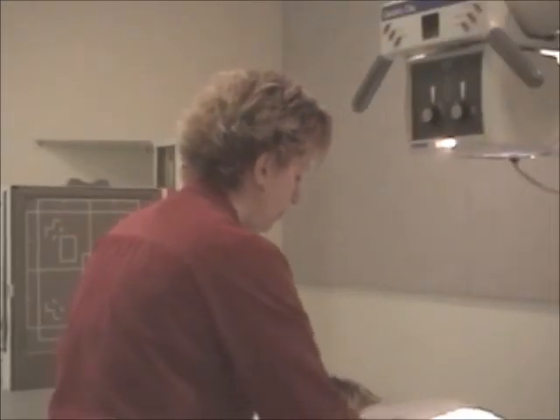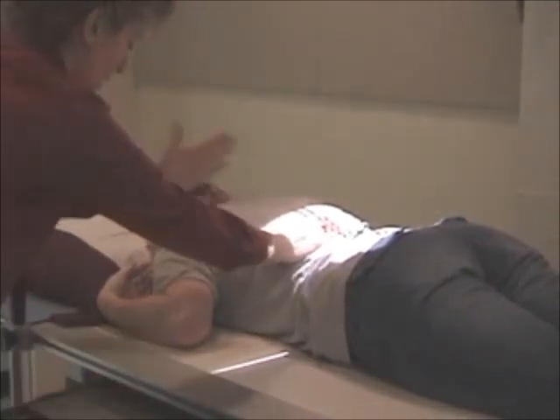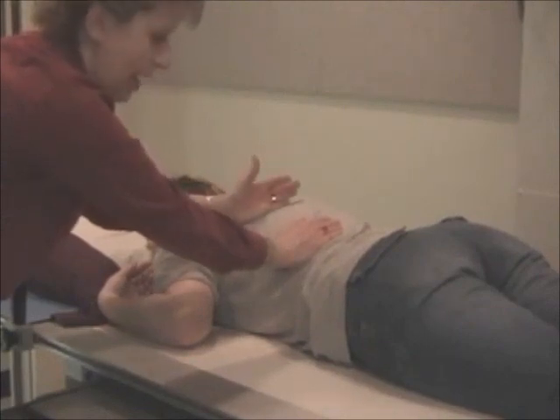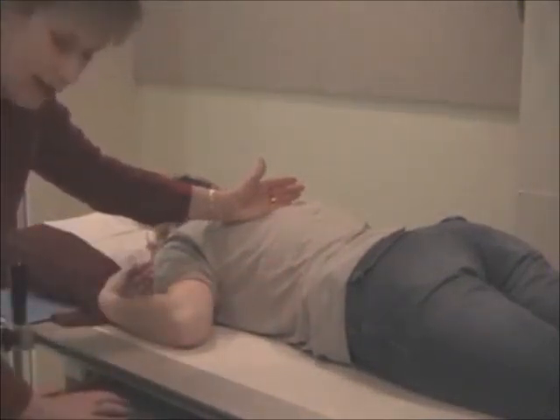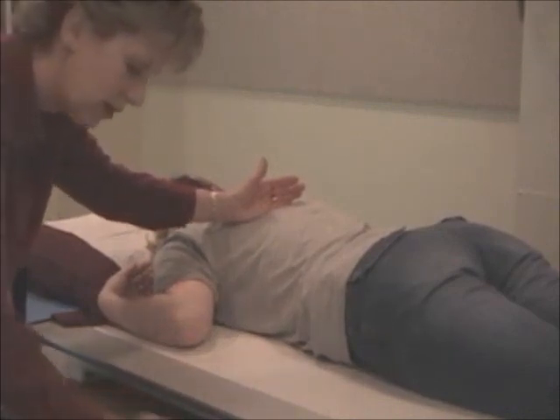Now what I like to do is find the stomach after I do a KUB. I'm validating my decision that it's okay to do a KUB. Here's the tip of her scapula, iliac crest. Halfway is the stomach. The stomach is right there. And I look at the film's edge, and you can see that the film's edge is going to clear that stomach. So I am happy with this patient being on a 14/17 film with the iliac crest to the center, because I verify that I'm actually putting the stomach here, and small bowel goes down here.